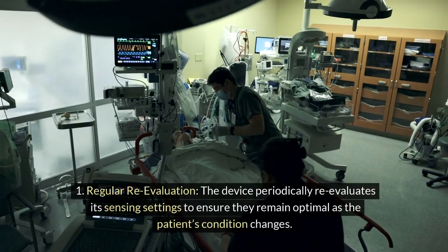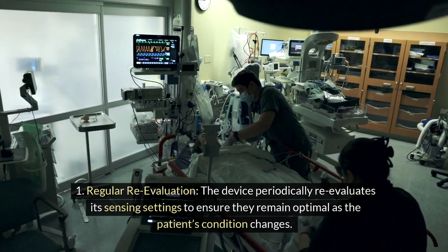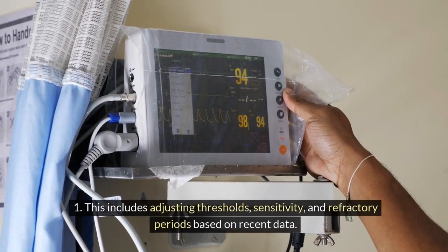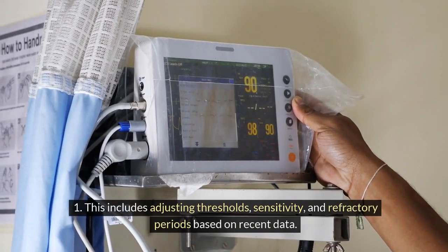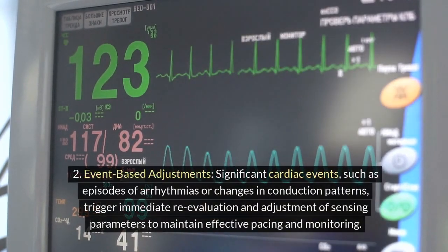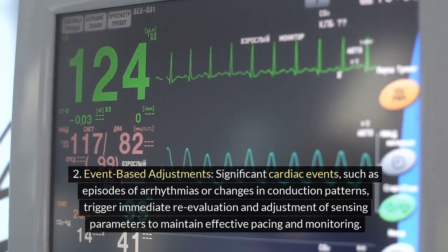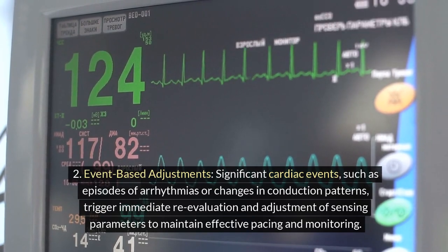Periodic re-evaluation. 1. Regular re-evaluation. The device periodically re-evaluates its sensing settings to ensure they remain optimal as the patient's condition changes. This includes adjusting thresholds, sensitivity, and refractory periods based on recent data. 2. Event-based adjustments. Significant cardiac events, such as episodes of arrhythmias or changes in conduction patterns, trigger immediate re-evaluation and adjustment of sensing parameters to maintain effective pacing and monitoring.